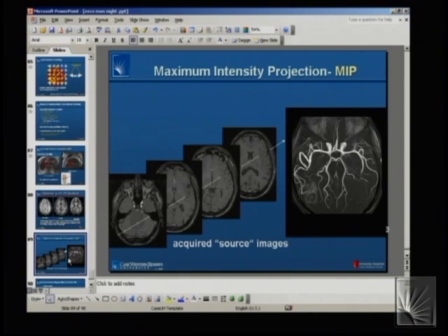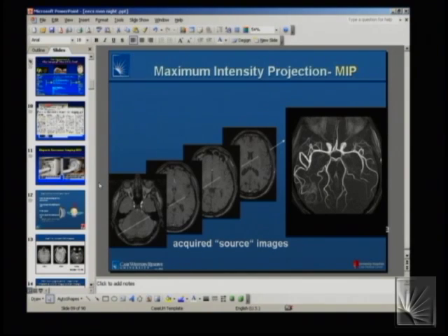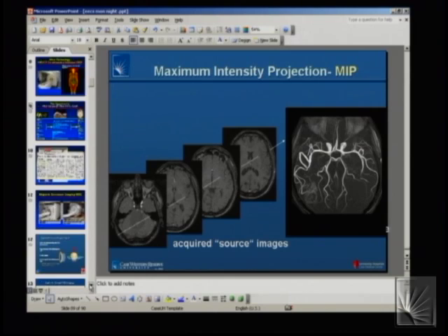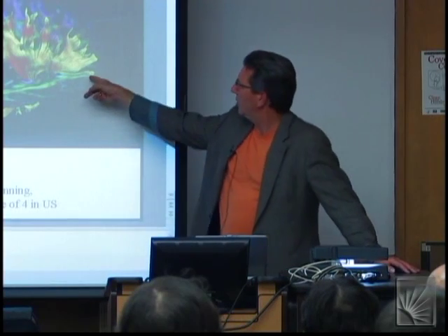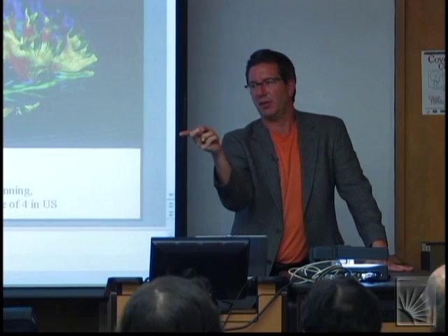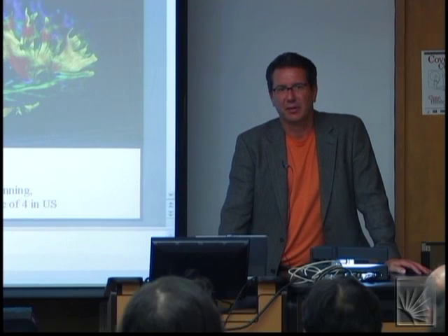The diffusion application that we showed earlier, with these tractography maps, is another example where the technical challenges are really phenomenal to be able to process these huge amounts of data. To do this type of acquisition, we have to encode for sensitivity to motion in this direction, then this direction, then this one, and then the eigenvalues, and we use that to create these maps.